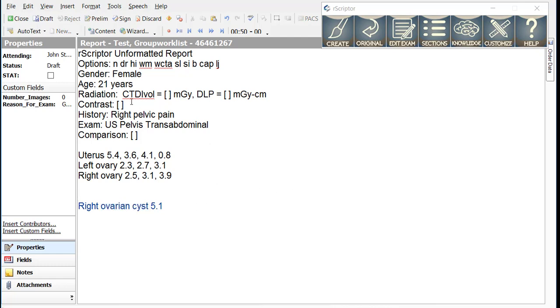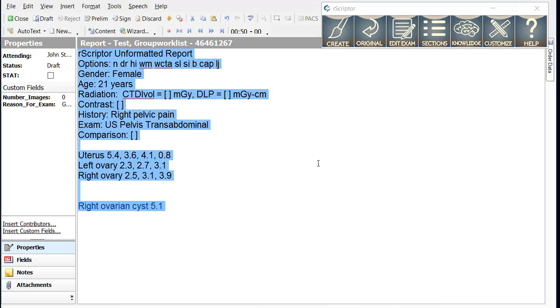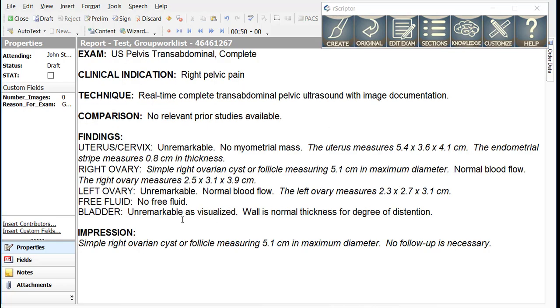When I create this report in a 21-year-old female, we simply get a statement that there is a cyst present in the right ovary, a cyst or follicle present, and that no follow-up is necessary because that is the ACR recommendations for this situation.